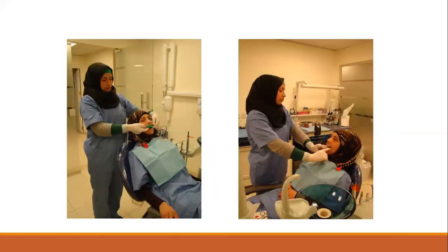نفس الطريقة في هاي الحالة. Here we're taking a lower impression. Lower jaw must be at تقريبا level of our elbow. I want to take an upper impression. نفس الإشي ال upper arch بده يكون تقريبا على مستوى الإلبو تاعي. هون البوزيشن تاعي بالنسبة related للبيشنت تقريبا clock تقريبا 8. هون كمان بيكون clock تقريبا 10.